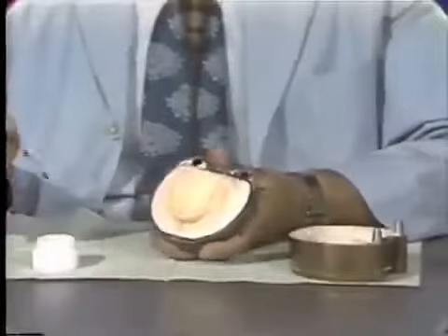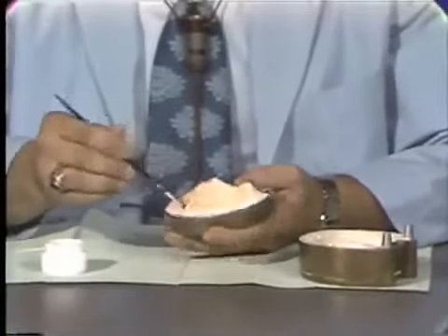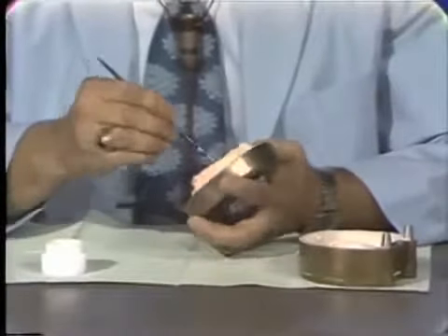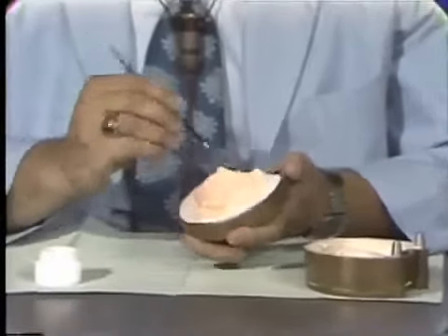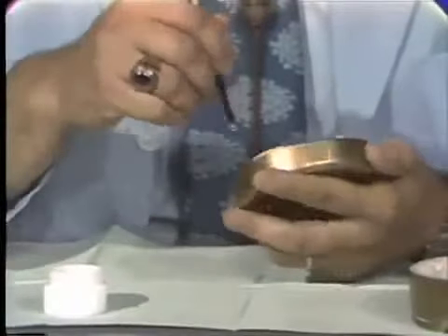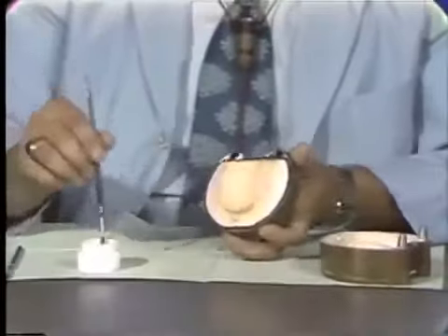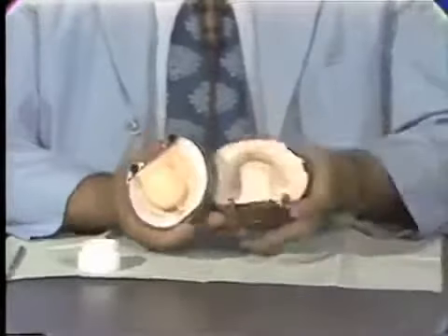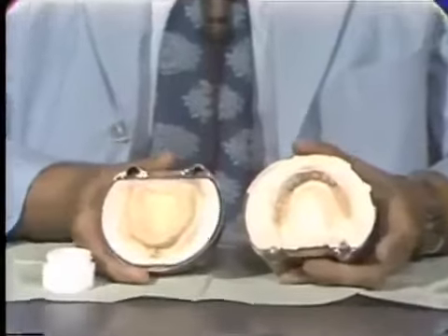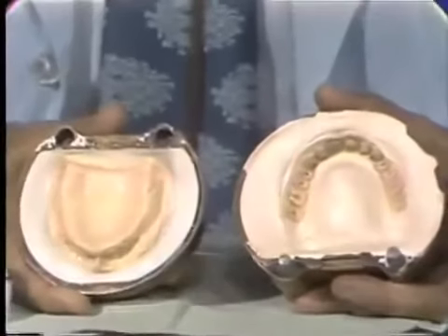Now we'll proceed with the other half of our mold. This half is very easy to do — you simply coat all the surfaces. Before alginate separators were available, it was much more difficult because we had to tin foil all the surfaces of the denture that we did not want the acrylic to adhere to. It was much more time consuming and really didn't do as good a job as the alginate separators. We have now applied the separating media to both halves of the flask, and I will leave for a few minutes while this is drying and we will come back and pack the maxillary denture.